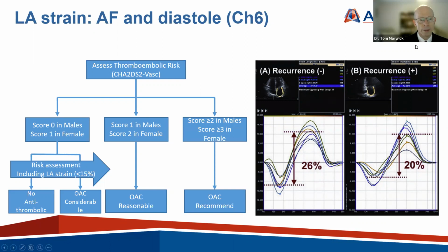I think one of the challenges really is that the functional assessment of the atrium has been problematic for us before, and here is a reasonably simple and seemingly pretty robust marker of atrial function. Next slide, please, Christine.